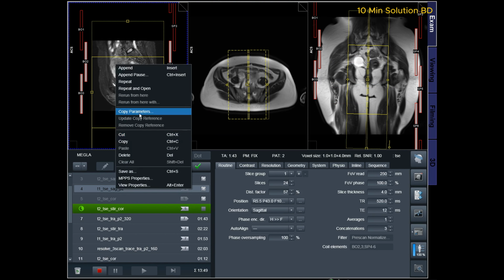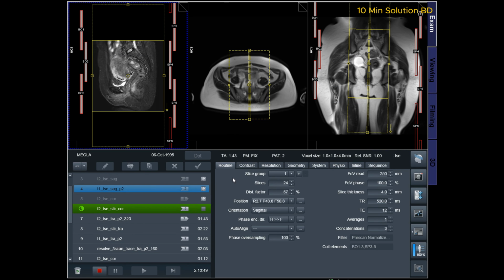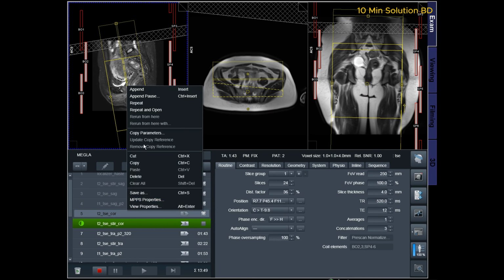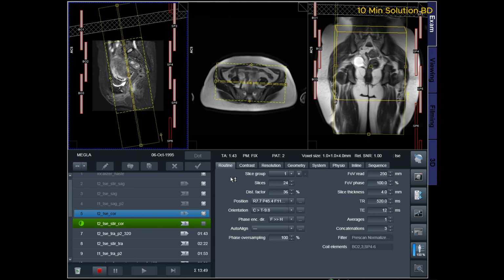Pregnancy, risk versus benefit ratio to be assessed. Ferromagnetic surgical clips or staples. Metallic foreign body in the eye. Metal shrapnel or bullet.